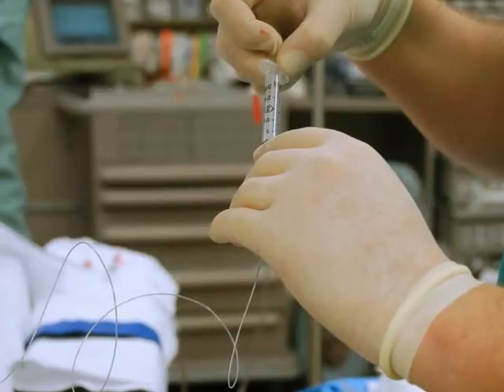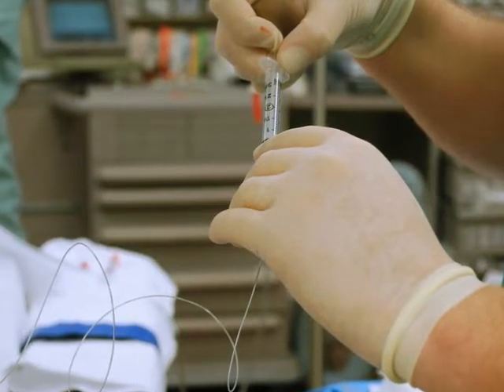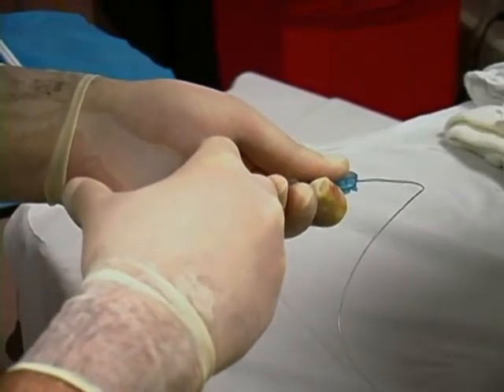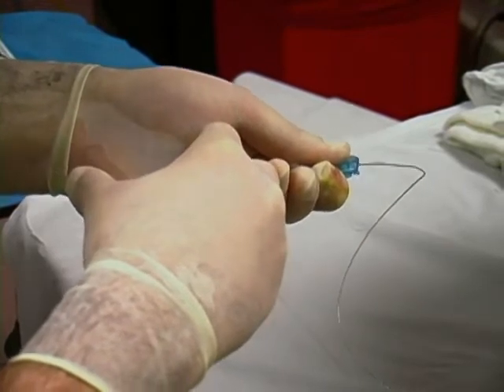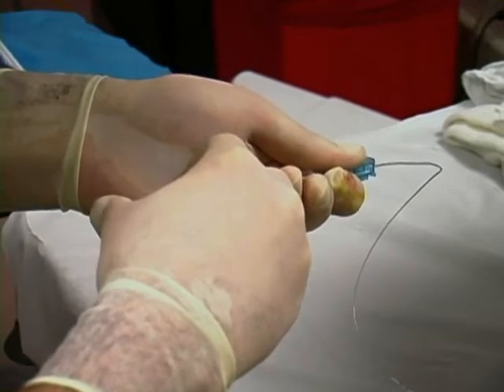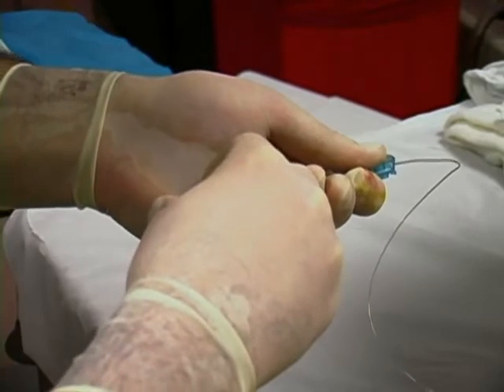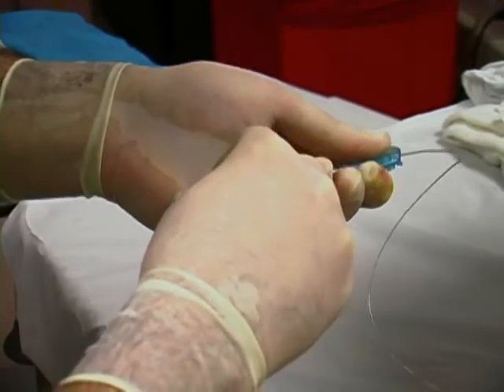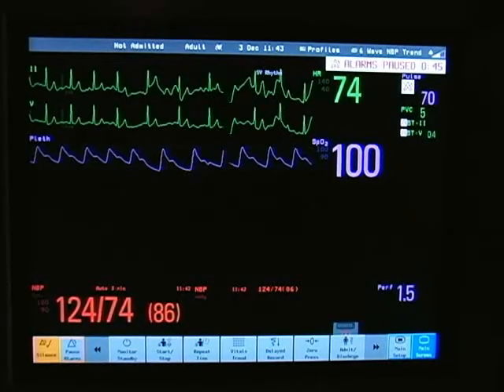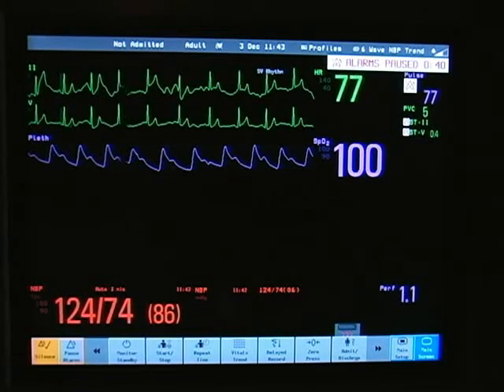Aspirate the catheter to check for cerebrospinal fluid or blood. Air bubbles or slow-moving fluid indicate proper placement. A test dose of 1.5% lidocaine with epinephrine is given following aspiration to ensure the catheter is not placed in an intravascular structure. Before injecting the test dose of epinephrine, notify the patient of symptoms that may be experienced if the catheter were not located in the epidural space. Also, monitor the patient for increases in heart rate or blood pressure, as these are signs of intravascular injection.